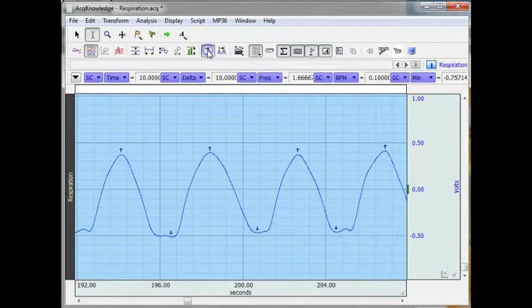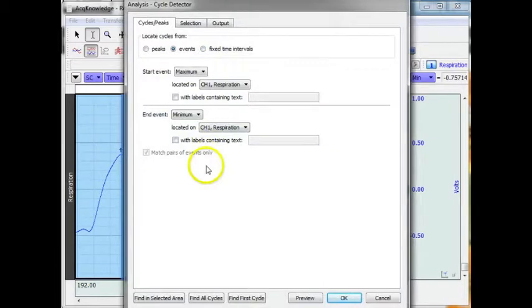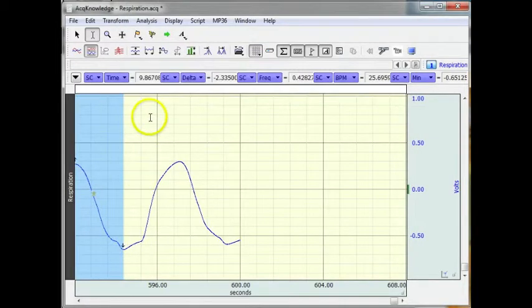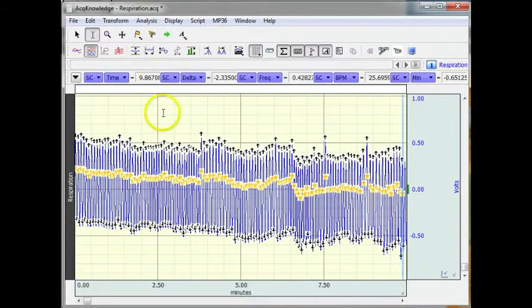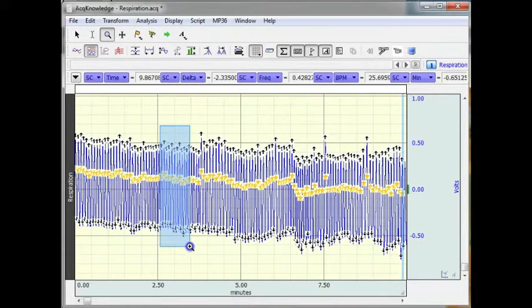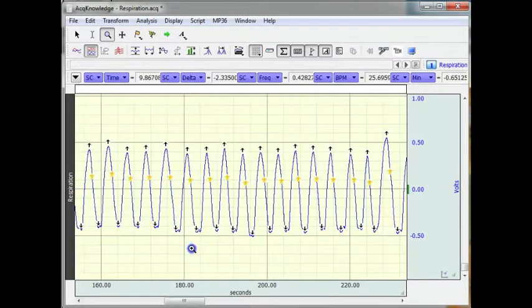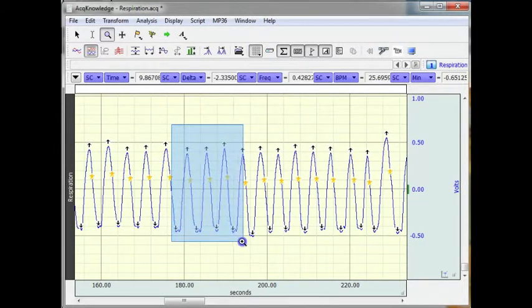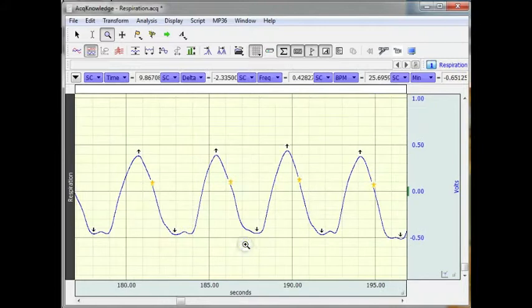It has already selected all my data. I am going to say find all cycles. Now if we compress our data down, we now have an event marker marking the point of interest.